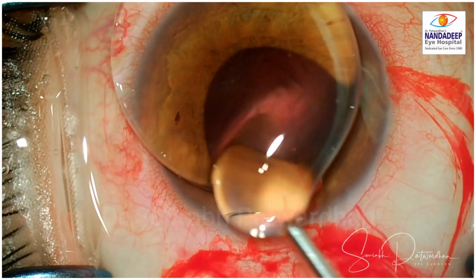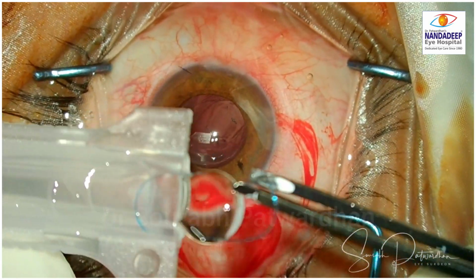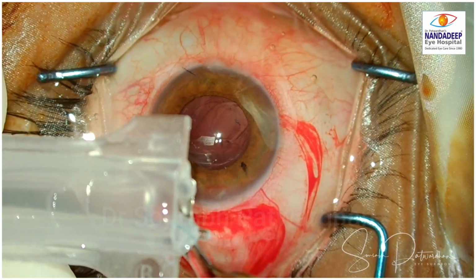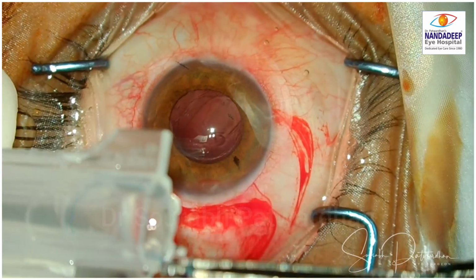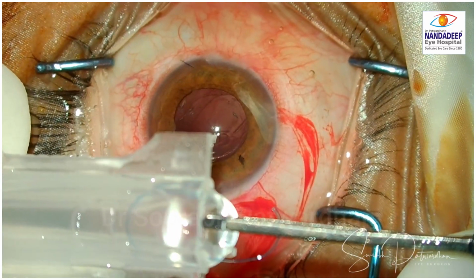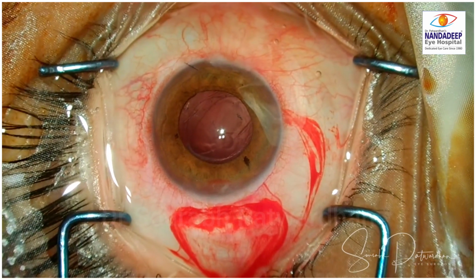Now I am going to use a 3-piece foldable IOL. Even the 3-piece PMMA IOL will do if it is available. So these PMMA haptics are much better for sulcus placement because of their springy action. They fit into the sulcus well.